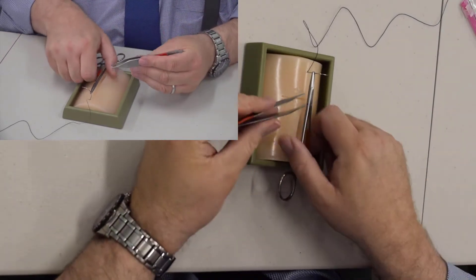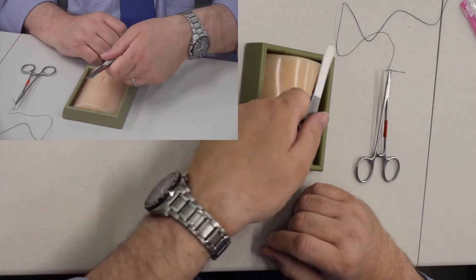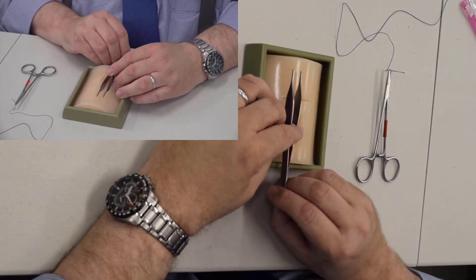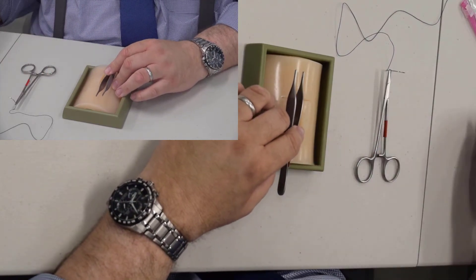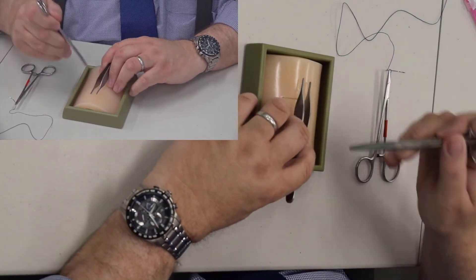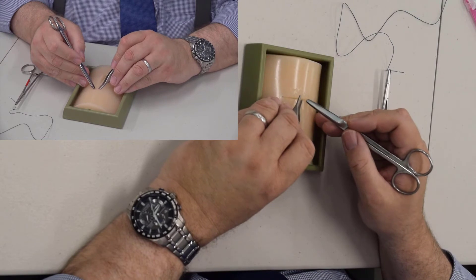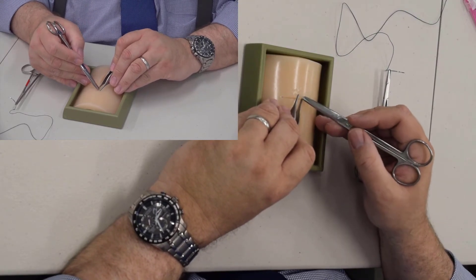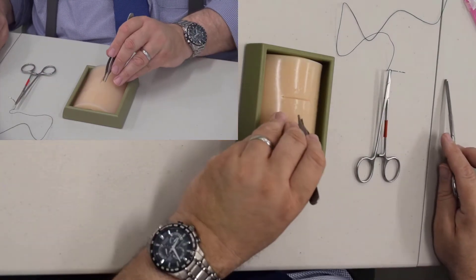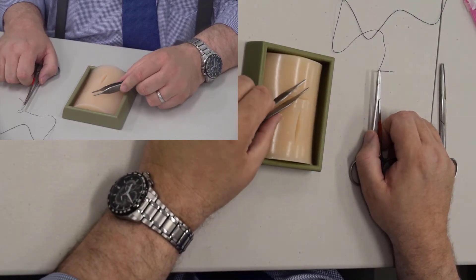This is a pair of Adson pickups, or forceps. We don't call them tweezers — in your house you call them a tweezer, but in the operating room they're called a forcep. These are the correct type of forcep to learn to sew with because they have teeth, they have ridges here. The ones that come in almost all suture kits you order from Amazon just have a rat tooth — one single tooth. Those are skin forceps for grabbing skin. These are the ones you should use to learn to suture with.